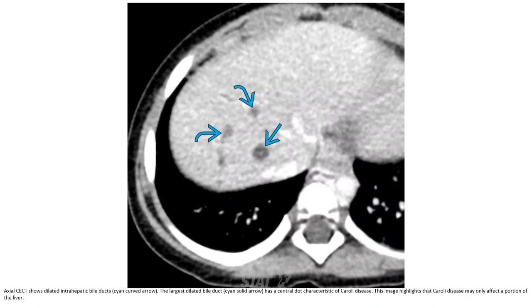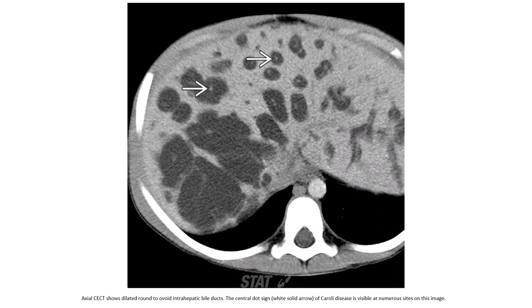Contrast-enhanced CT shows dilated intrahepatic bile ducts. The large, dilated bile ducts have a central dot characteristic of Caroli disease. This image highlights that Caroli disease may only affect a portion of the liver. Contrast CT also shows dilated round to ovoid intrahepatic bile ducts, with the central dot sign visible at multiple sites on this image.